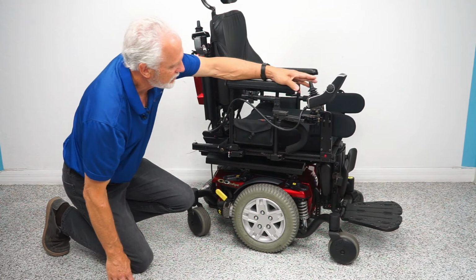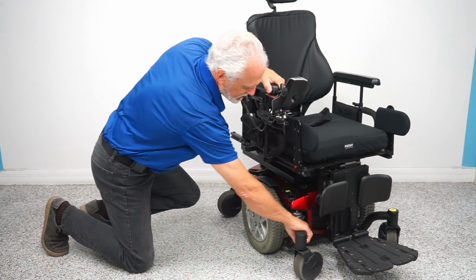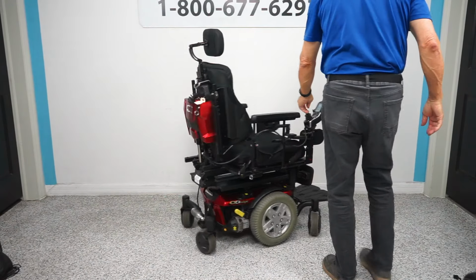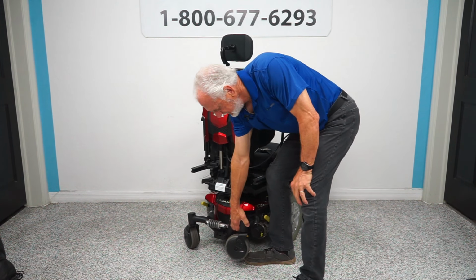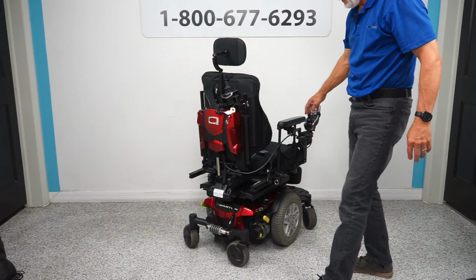And I want to show you something else, folks. Look at this suspension right here. That huge suspension is for this fork. You have the same thing on the other side, and you have the same suspension in the back, folks. Right here, this suspension covers these two forks. They are independent. If I raise this, you can see the other one stays down, okay?